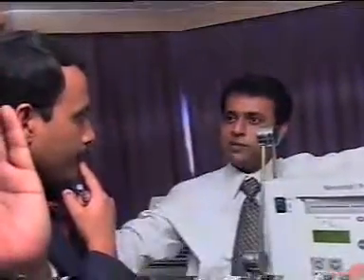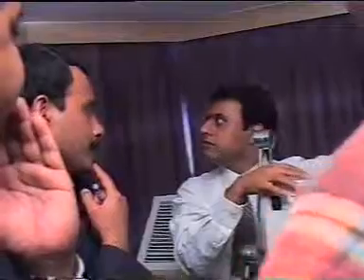Another thing is, फिर बाद में RDS आए तो डायरेक्टली फ्लो हो जाता है कि इसमें PIP इतना रखने का, PEEP इतना रखने का, FiO2 इतना. कौन सा क्वेश्चन है? No, he asked what settings are to be kept for what babies. Is that what you wanted to ask? How to assess which setting?